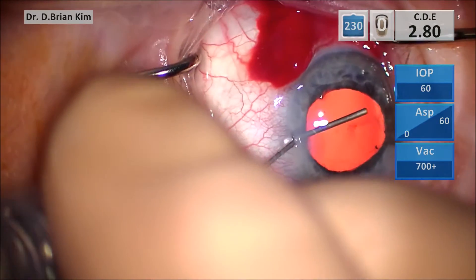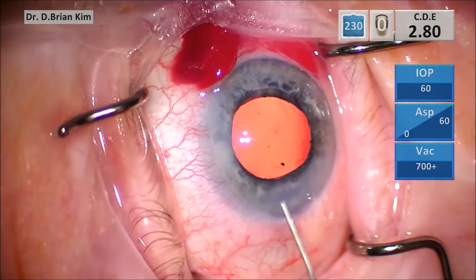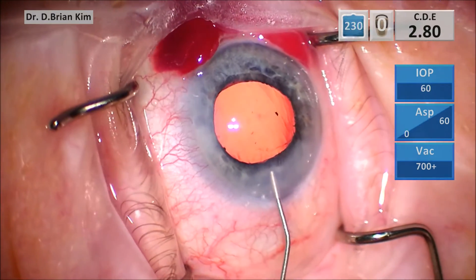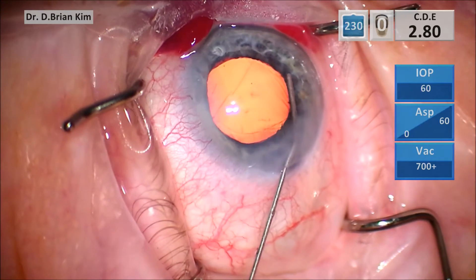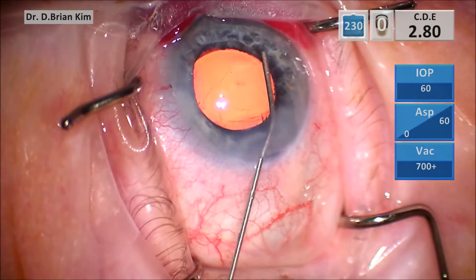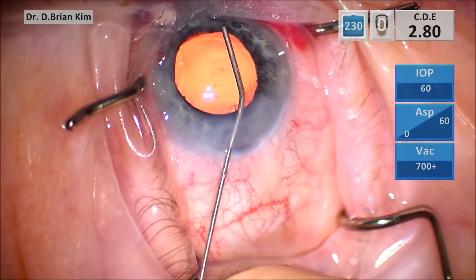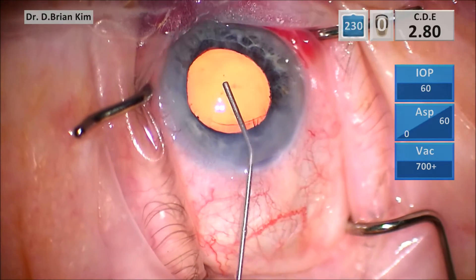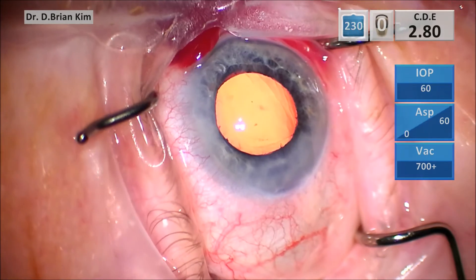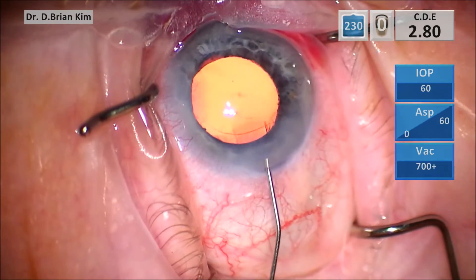What I do here is use the cannula to push the iris peripherally so that the iris is no longer under capture. I find the edge and just gently push the peripheral iris in such a way that it's no longer captured by the optic, and that works fairly easily. As you inflate the eye, make sure you don't over-inflate.